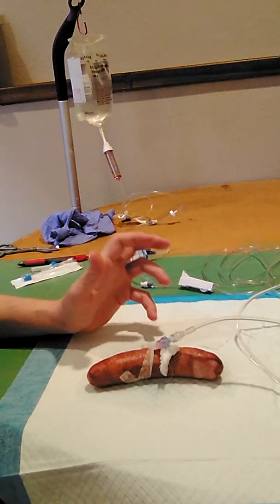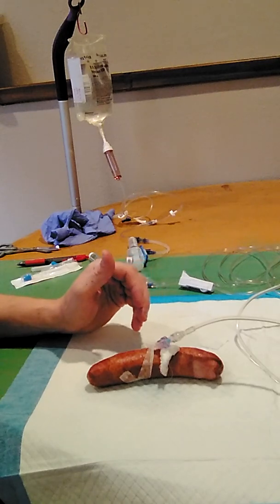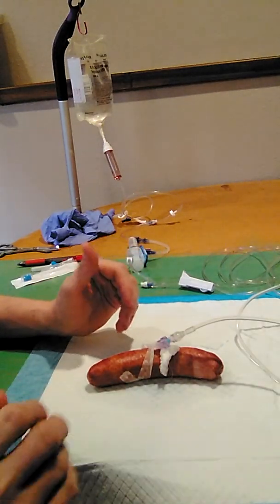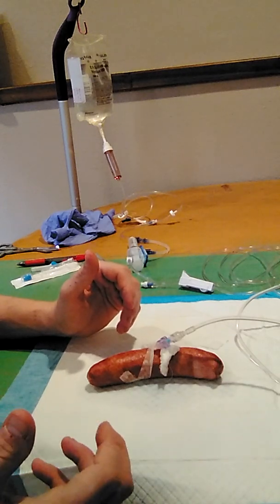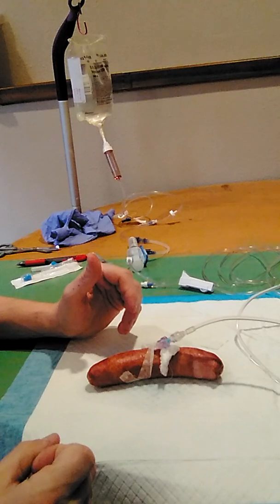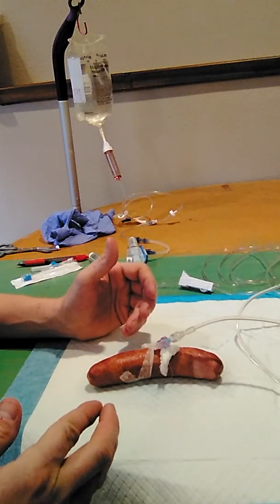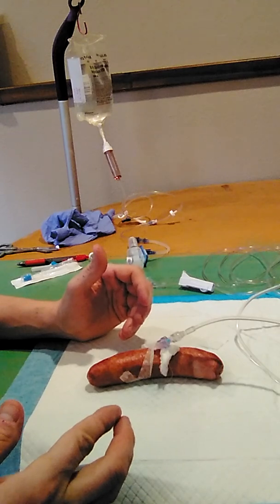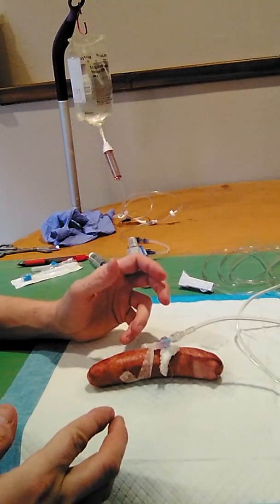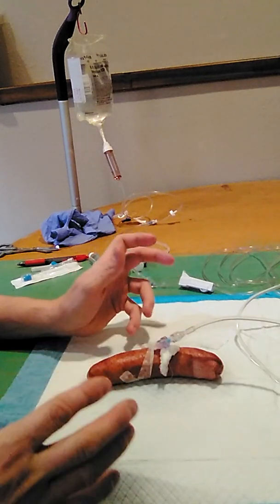So now I'm going to show you how to do an IV push medication through a saline lock. Again, the first thing I need is an order from the healthcare provider and the MAR for this medication. And I'm going to do the 3-check method, determining the rate to administer this medication and what sort of IV push is specified. So 5 milliliters I see is to be specified here, and then a medication administration, and then 5 milliliters after that.